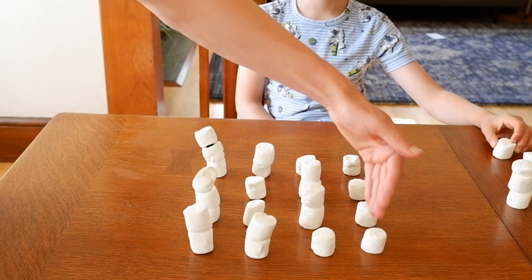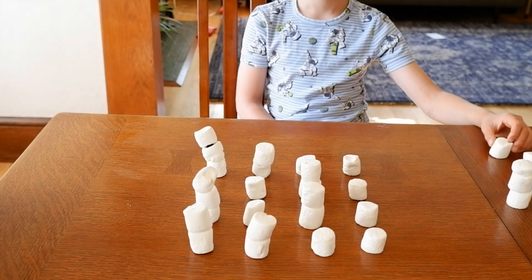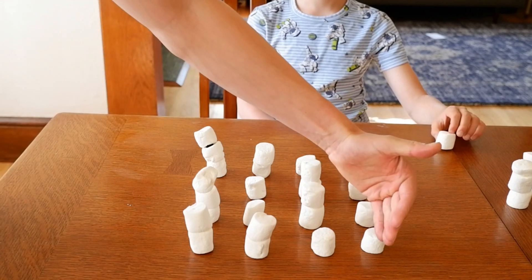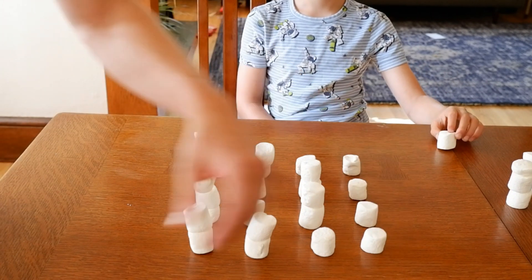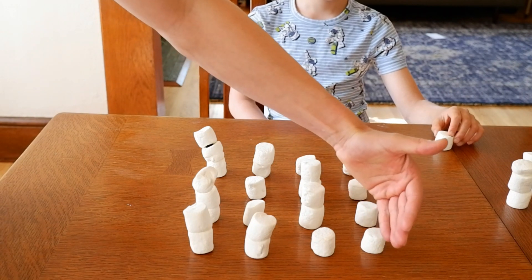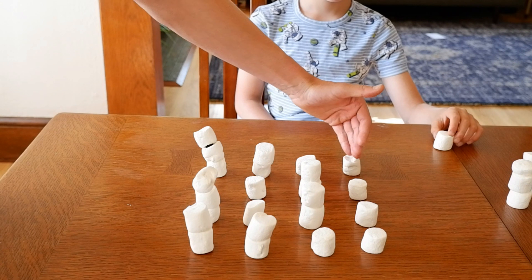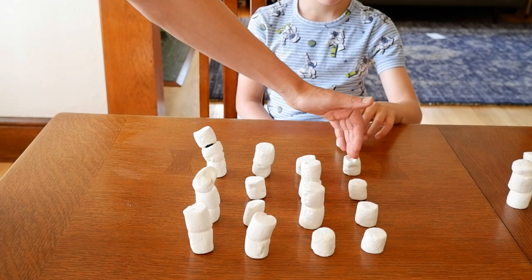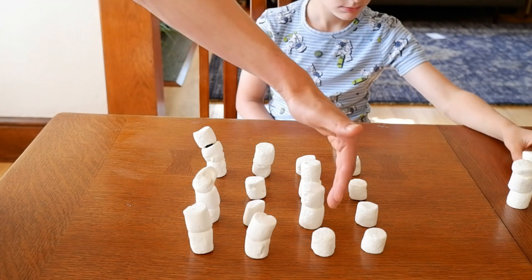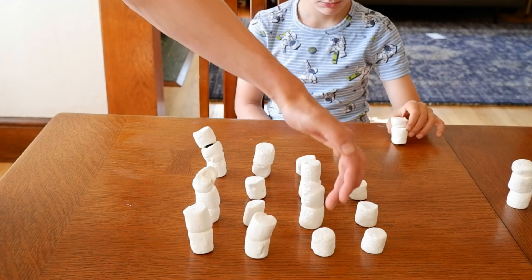What we're going to do here is look along each direction. First we're going to show you what the average intensity is — that's something we often like to do because it reduces noise in our images. So if we take an average along this direction, the average of four divided by four is just one. Then here we take an average along this direction.